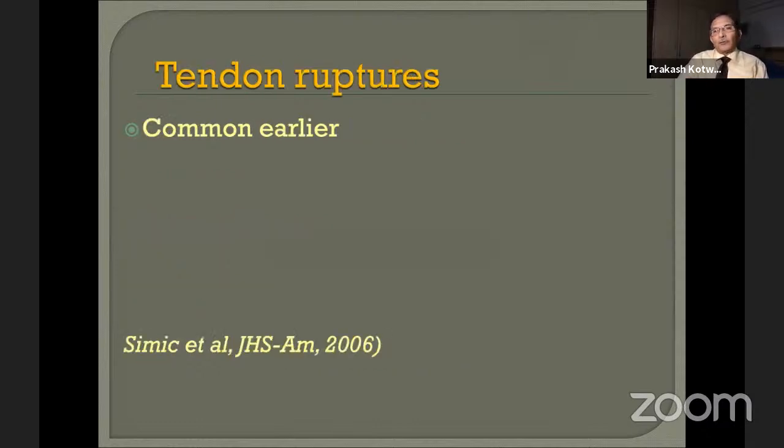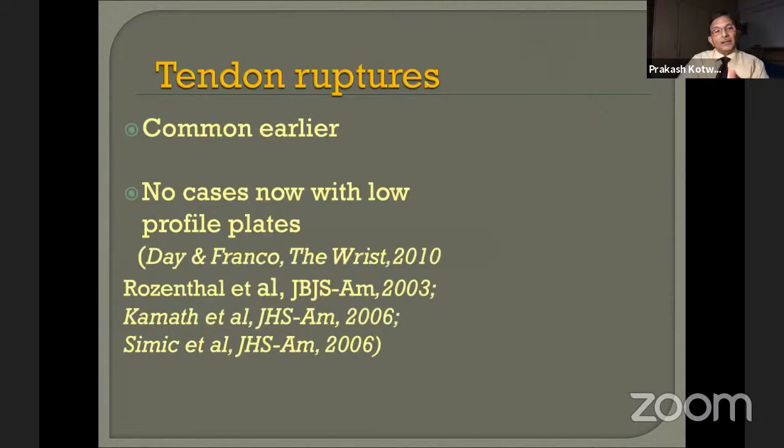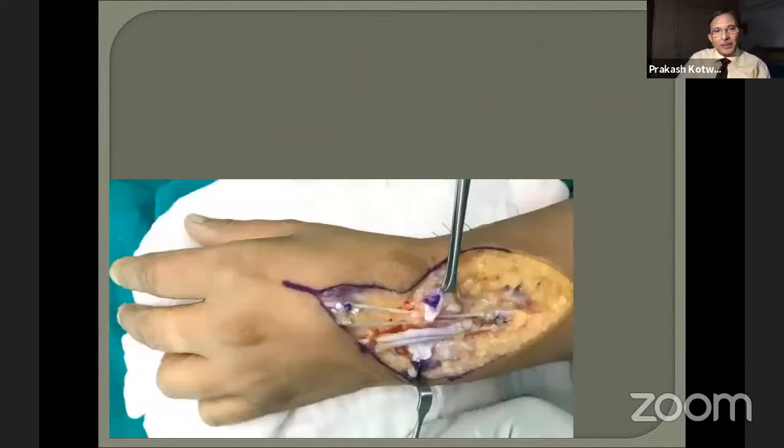Now it was common earlier, but now it has been reported that there are no cases, because the plates are low profile, and there are so many references which claim that they have not seen any case of tendon ruptures after the dorsal plating.